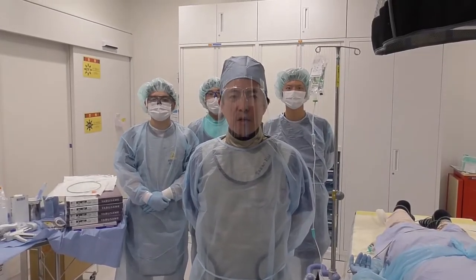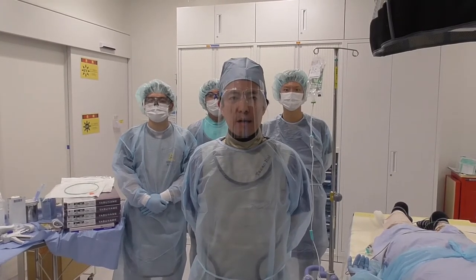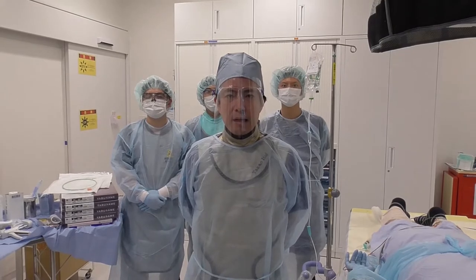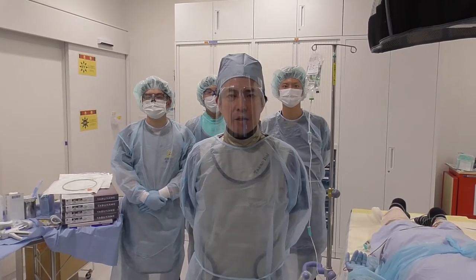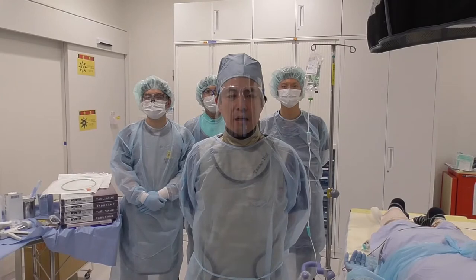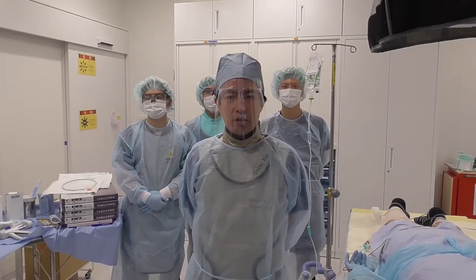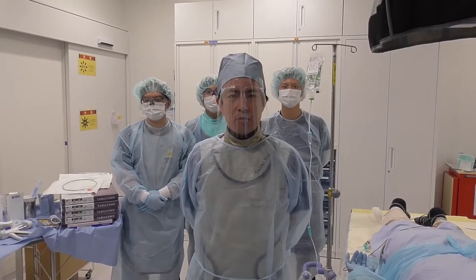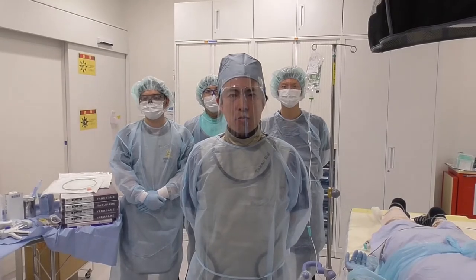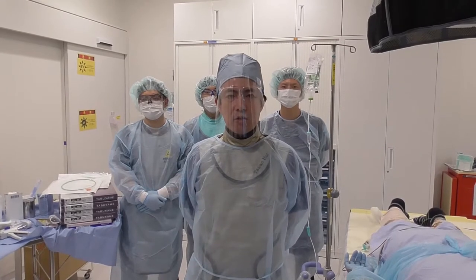Hello everyone. I'm Takao Itoi at Tokyo Medical University Hospital. In this live demonstration, I'd like to perform interventional EUS, in particular EUS-guided hepaticogastrostomy. The patient has obstructive jaundice and duodenal obstruction due to recurrent pancreatic cancer. Last week, we performed ERCP first, but unfortunately, due to duodenal obstruction, ERCP failed. So today, we switched to interventional EUS.